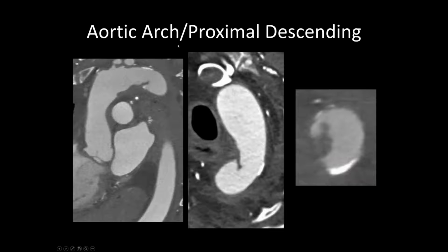While we were doing this, we also scanned around and we looked at the aorta because we're always concerned about what approach is going to be taken and how does the aorta look in that sense. So here you can see the aortic arch, and you actually see this kind of just deformity attached to the wall, and it seems like it could be an artifact, a dissection flap, or something else, or it could be something more severe like a thrombus or an atheromatous plaque. And so, just the way it looks, I think there was some concern.